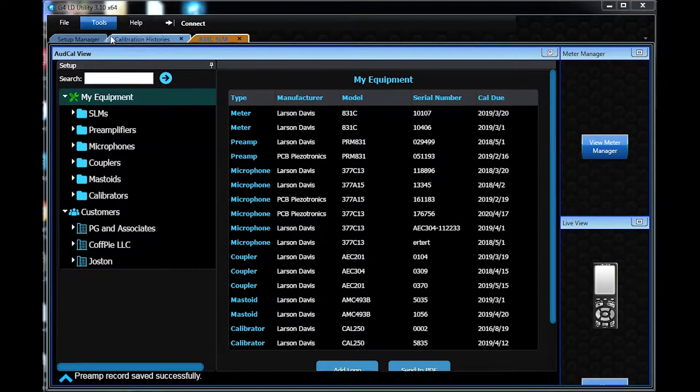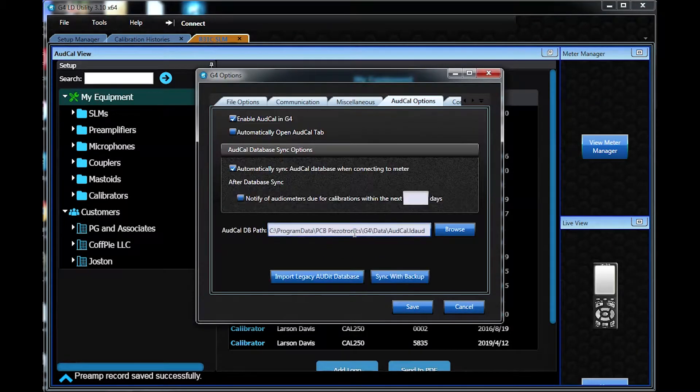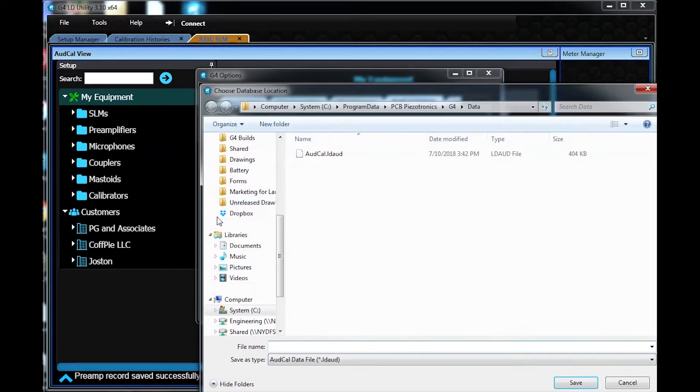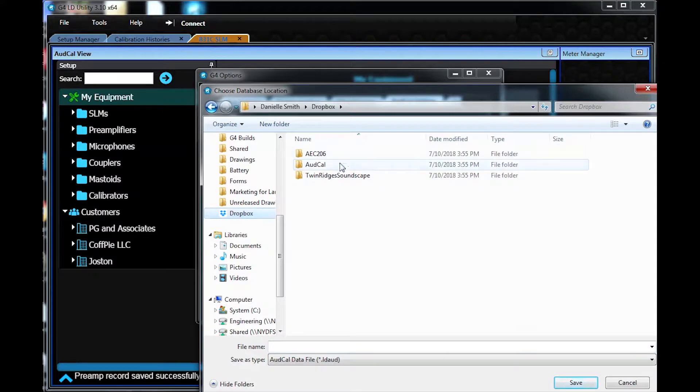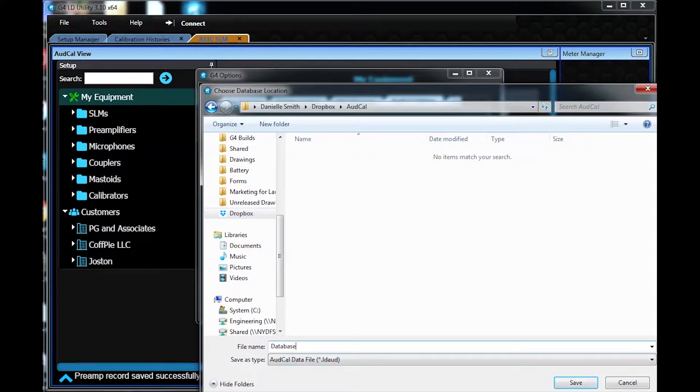The Sync database can be anywhere your computer can access, including a cloud-based system. You can update the Sync database file from anywhere.